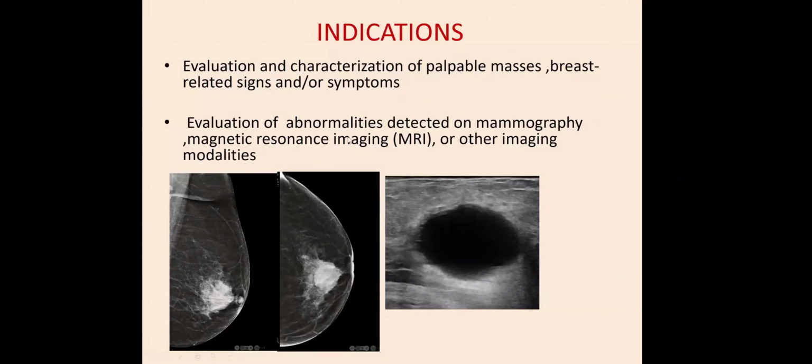Also in evaluation of abnormalities detected on mammography or MRI. There is the second-look ultrasound that we do in case of any finding on MRI, so that perhaps it can be done easily on ultrasound, or any lesion detected in another imaging modality like even CT or PET-CT.